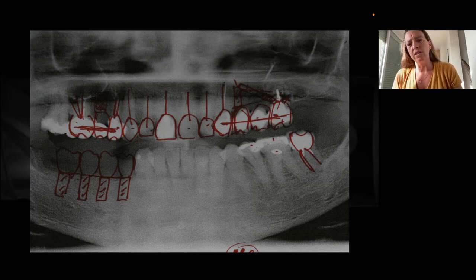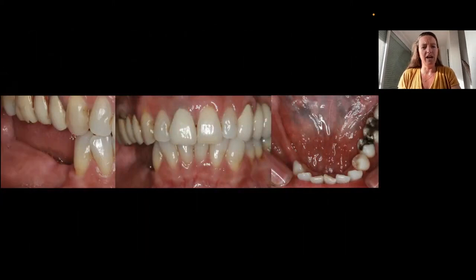And in the upper jaw, as you can see, I already talked to you a little bit about the tilting implants, but as you can see, this bridge on the third sextant is not viable, so we have to extract that root of the tooth number 27, and here we have to check if we have available bone to accommodate what we call a half all-on-4, so a straight implant and a tilted one. So in this case, as you can see, this is the intraoral picture. You can see a very thin ridge, a ridge that is demanding in terms of rehabilitation, in terms of placing the implants.